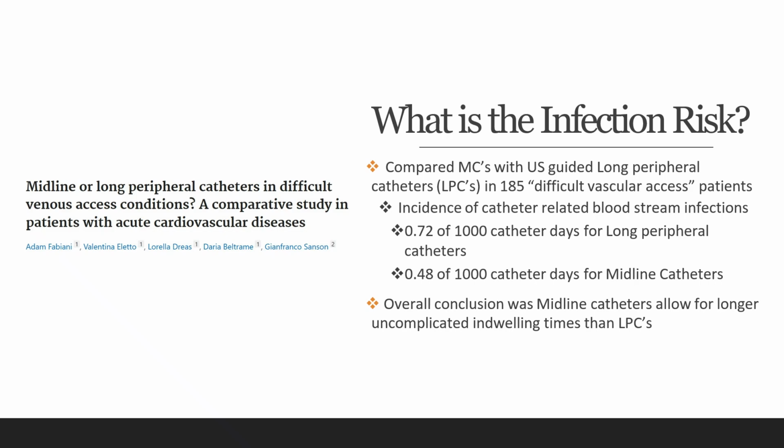One of the things that a lot of hospital systems will look at when we're replacing these catheters is how often we're seeing infections. These are rates or metrics they may track. So that's a big question. Is there any advantage of midline catheters over our standard peripheral IV catheters, such as the long ones that I talked about earlier? This study compared midline catheters with ultrasound-guided long peripheral catheters in 185 difficult vascular access patients. The incidence of catheter-related bloodstream infections was about 0.72 per 1,000 catheter days for the long peripheral IV catheters, and about 0.48 per 1,000 catheter days for the midline catheters. Their overall conclusion was that midline catheters allow for longer uncomplicated indwelling times than long peripheral IV catheters.